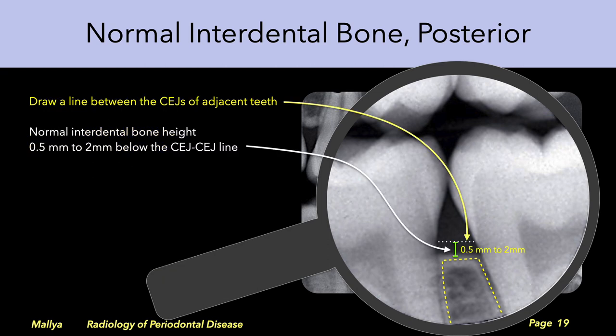To evaluate the height of the interdental bone, draw a line between the cementoenamel junctions of the adjacent teeth. The interdental bone should normally be 0.5 to 2 mm below this line. Note that the edges of the interdental bone are sharp and that the adjacent PDL space is of uniform width.